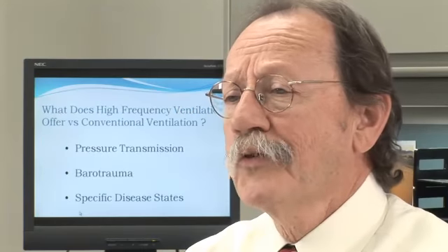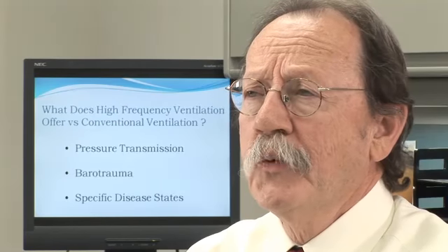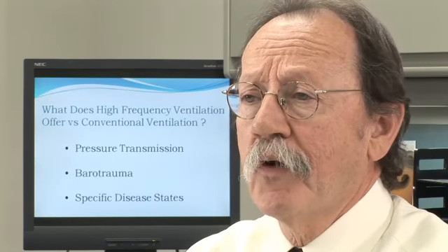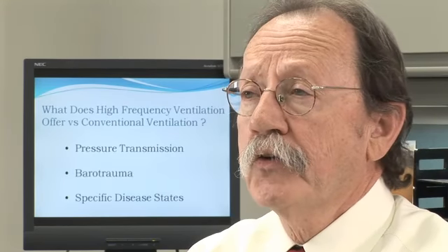So what does high frequency offer over a conventional ventilator? Why use it in the first place? Well, one, as we showed, there's decreased pressure transmission or volume transmission. So you can decrease volume trauma because you also get decreased peak to trough pressures in the airways. You decrease barotrauma to the airways and air leak.